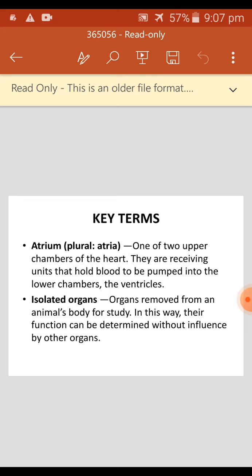Fourth one, bubble monitor in the form of ultrasonic sensors that regulate the flow rate of the affected pump when air is detected in the system. Fifth one, pulsatile flow control for creating and controlling a pulsatile flow profile.